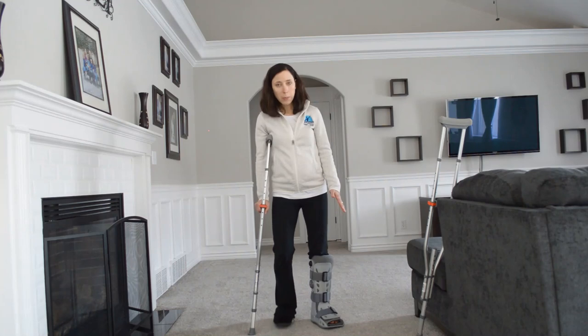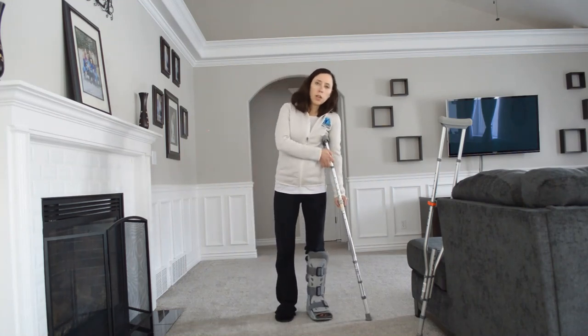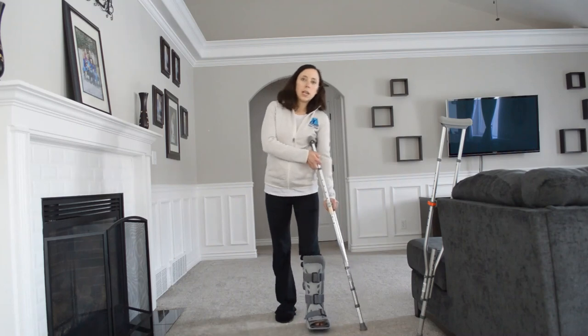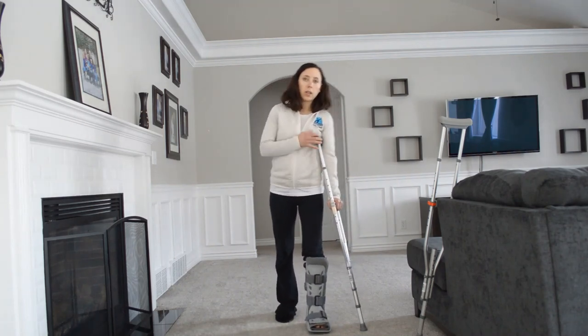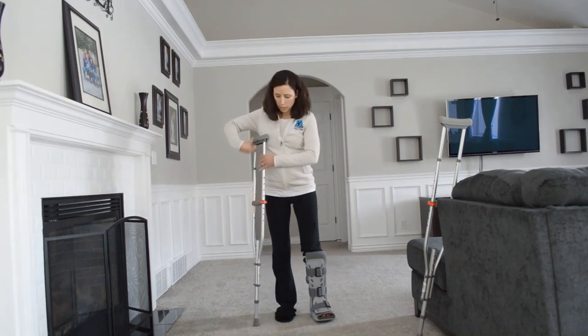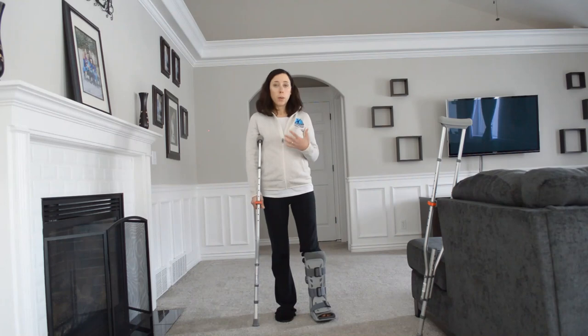A lot of people think that you want the crutch on the injured side, but when you do that, you end up leaning over to try to support the weight, and that's not very good alignment. So you actually want it on the non-injured side to help keep you upright as you step.